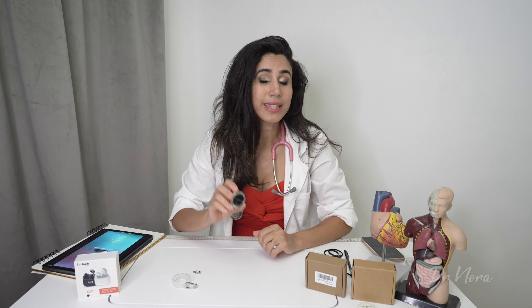Is this the stethoscope of the future? In today's episode of Dr. Nora, I take you through everything you need to know about this tiny little listening device known as the Stemoscope Pro.